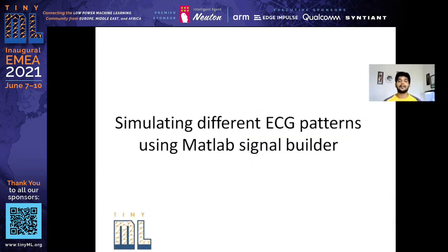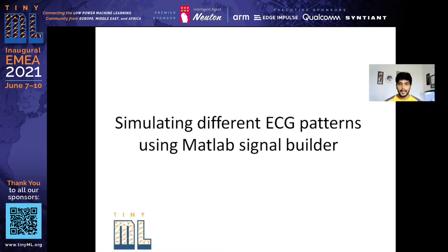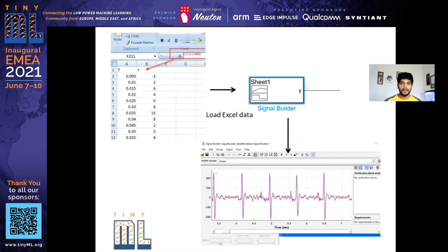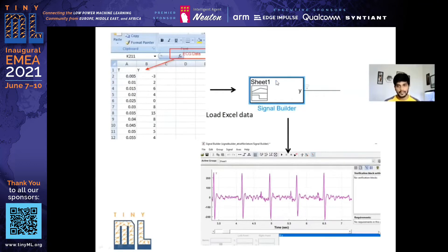Once I collected my ECG data, which is a normal one, I needed to generate datasets for atrial fibrillation and also for AV block one — first degree heart block. I used MATLAB Signal Builder for that. From the Arduino serial monitor, I collected the data into an Excel sheet with a time log and the ECG data. I loaded this Excel sheet into the MATLAB Signal Builder.